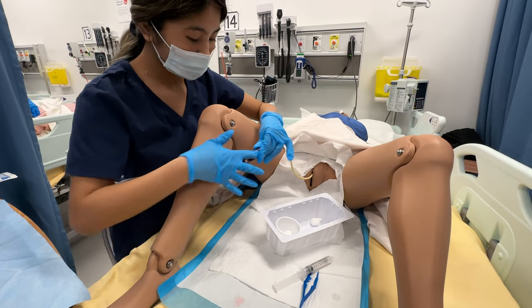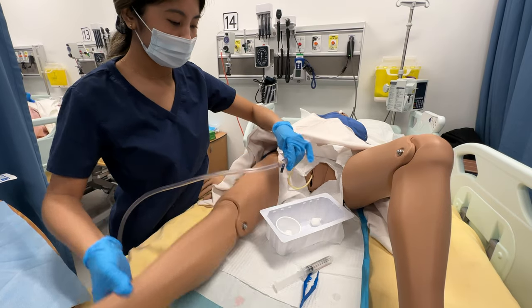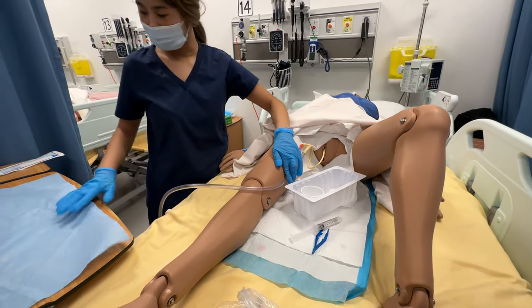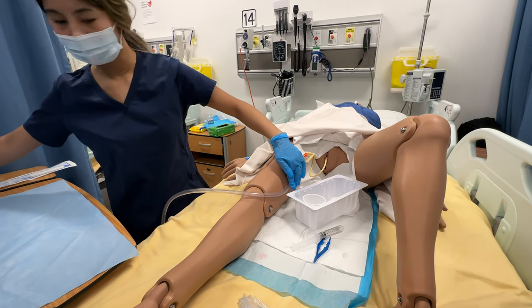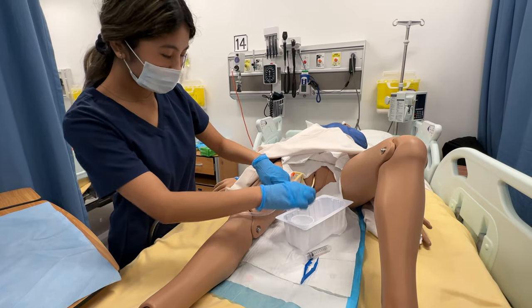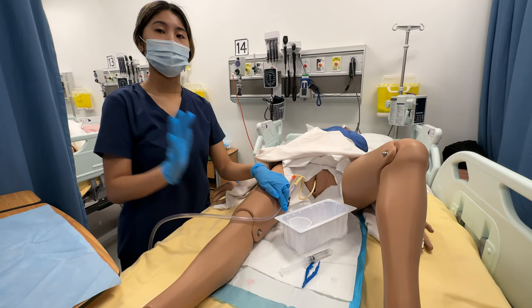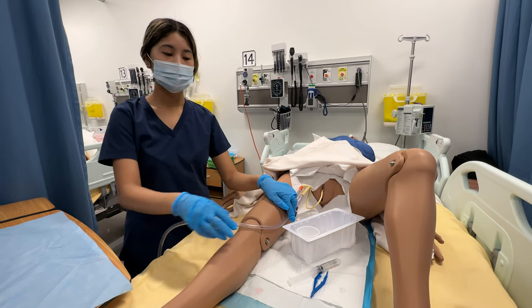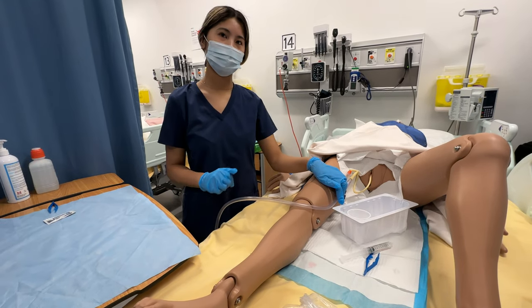Okay, once that's attached to the drainage tube, I can reposition my patient. I'll attach the catheter to the side with some tape. After that, we're going to remove our gloves, perform patient clean-up, clean our sterile tray, and then we're all done. Perform hand hygiene. Thank you.